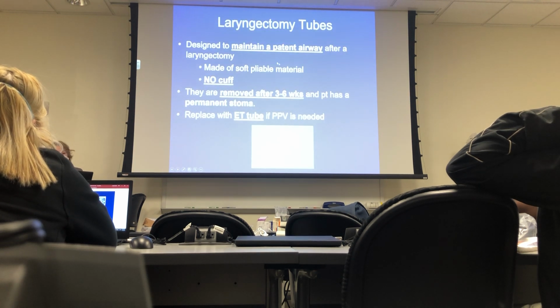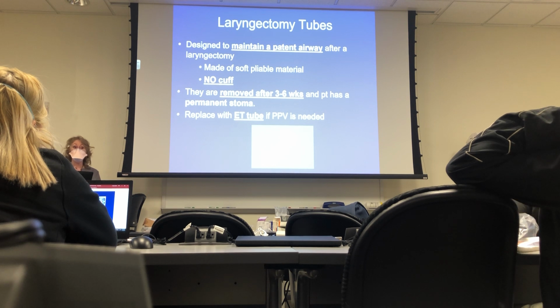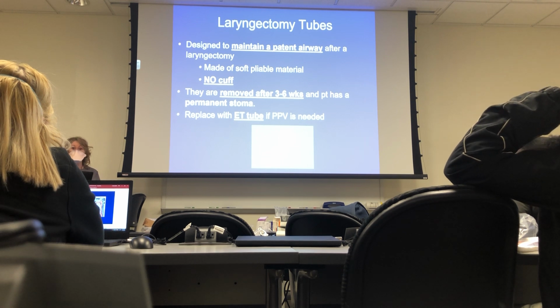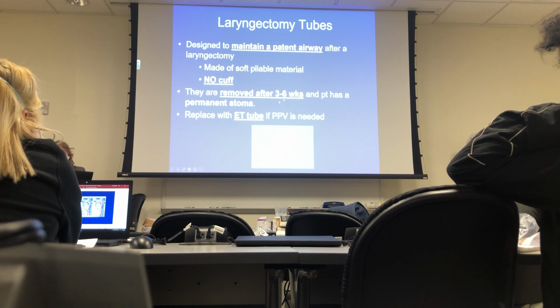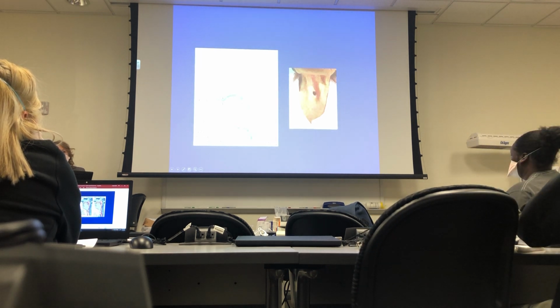All right, so the laryngectomy tubes, right after somebody has surgery, they want to maintain that stoma site for about 6 weeks, okay? So they put in what they call a little short laryngectomy tube until the stoma heals. Then they can take it out and those people have a permanent stoma, an open hole, okay? So the laryngectomy tube maintains a patent airway. There's no cuff on it, okay? It's inserted and in about 3 to 6 weeks it's taken out and this is what it looks like. Just a hole, the trachea is pulled up and attached to the stoma.